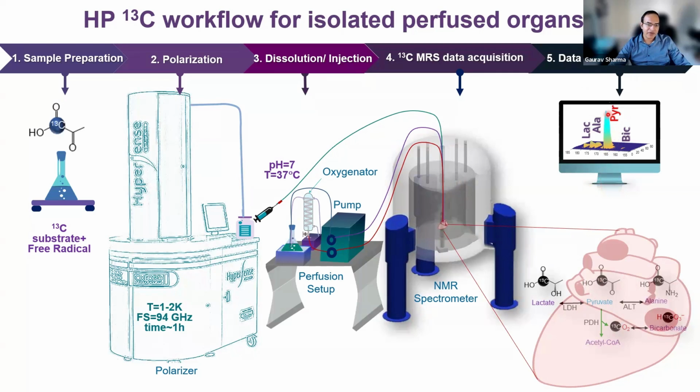You see that the pyruvate is a probe, and soon after you inject, the signal gradually decreases because of the loss of polarization. Also, soon after you inject, the downstream metabolites start appearing. That is the real metabolism you barely see in any other technology.